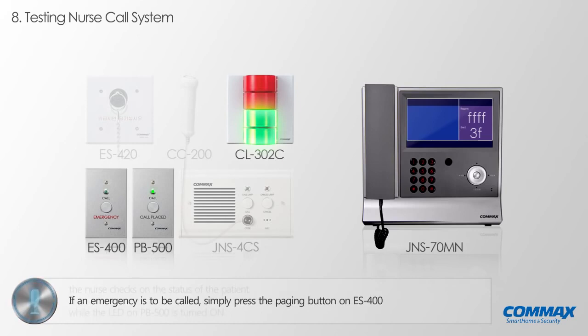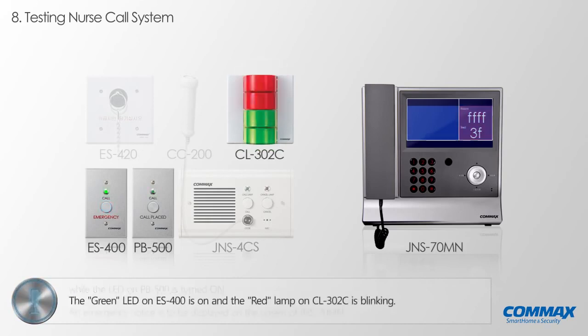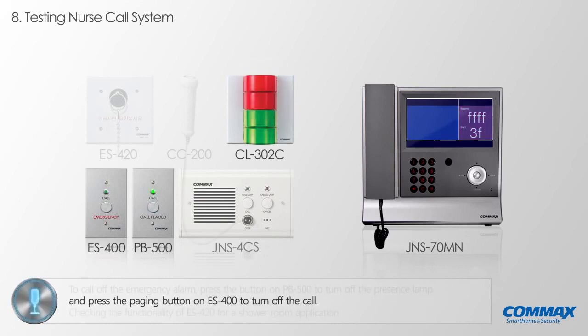If an emergency is to be called again after checking the status of the patient, please press the paging button on ES400. It is important to check the LED on PB500 is on when you press the paging button on ES400. As the button on ES400 is pressed, the green LED on ES400 is turned on, and red lamp of CL302C starts blinking. An emergency notice is to be displayed on the screen of JNS70MN. To call off the emergency alarm, press the button on PB500 to turn off the presence lamp and press the paging button on ES400 to turn off the call.